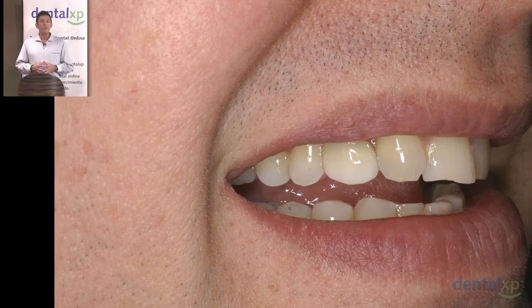I hope this gives you an idea of some of the future directions in terms of implant design, reverse engineering protocols, and the utilization of optical scanning at the time of surgery to facilitate provisionalization. And in cases where there are no incisions made, a final restoration can be fabricated with zirconium, lithium disilicate, or ceramic metal within 72 hours. Very exciting time to be involved in this type of tooth replacement dentistry.